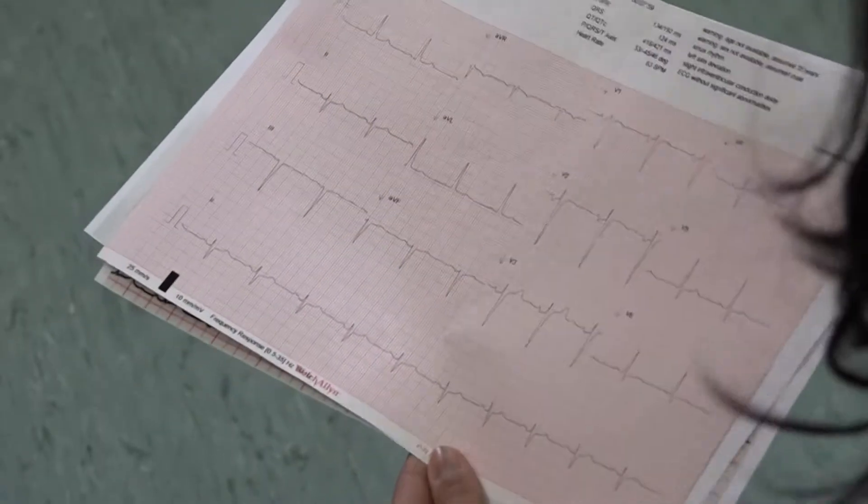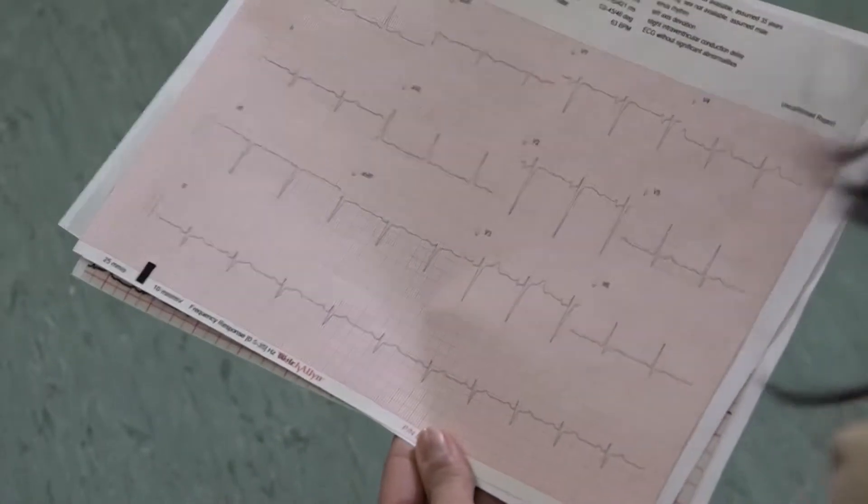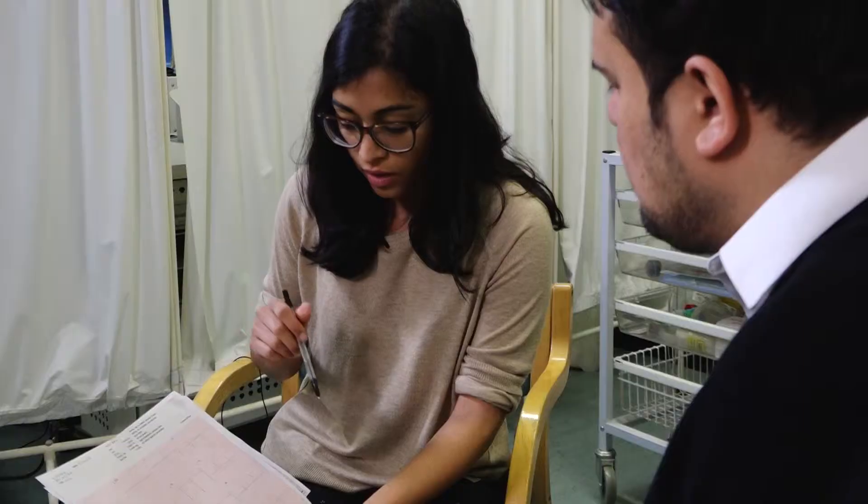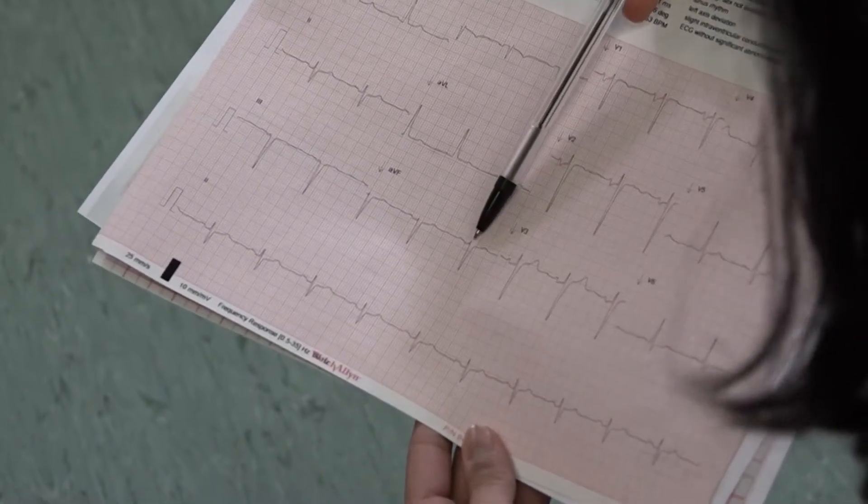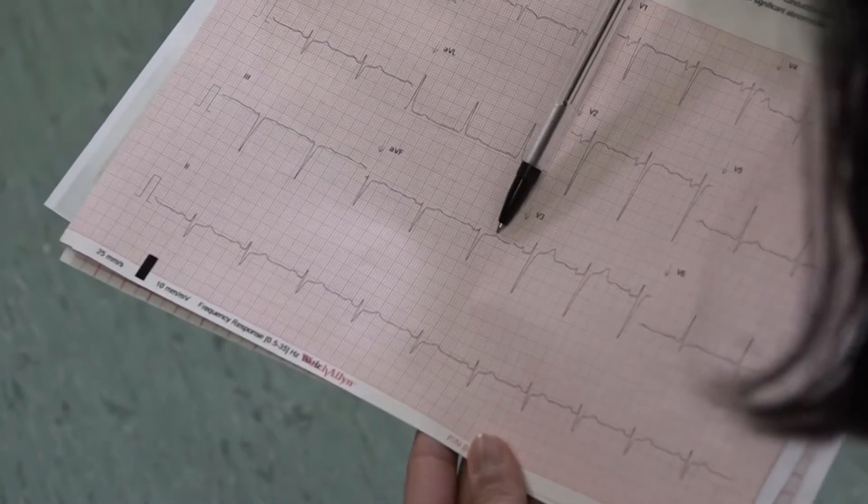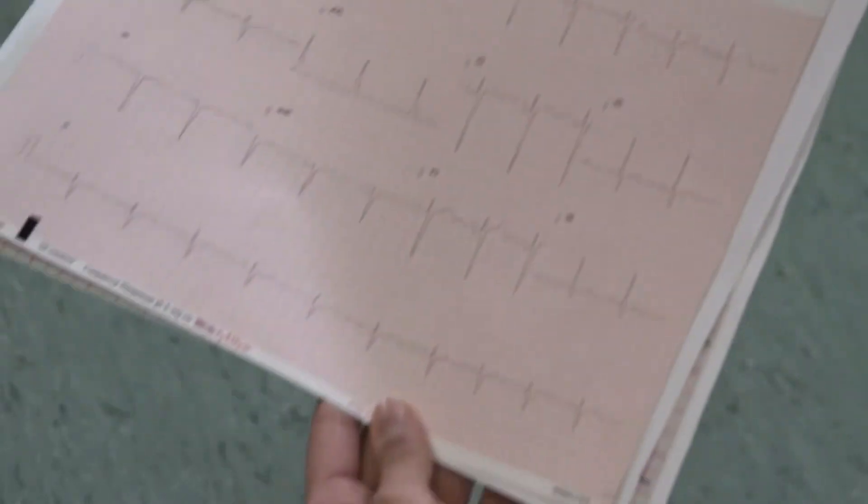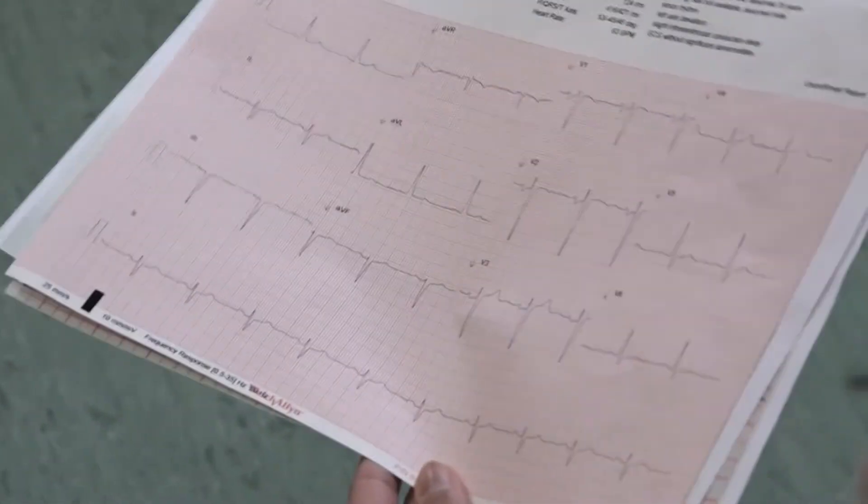In our original ECG there are no ST abnormalities, so we can move on and have a look at the T wave. The T wave, you want to look and see if it's abnormally large or abnormally small. You might also want to look at the interval between the Q wave and the T wave. If that interval is prolonged, you'll want to investigate causes for why that might be the case.